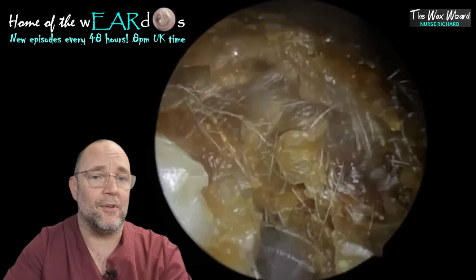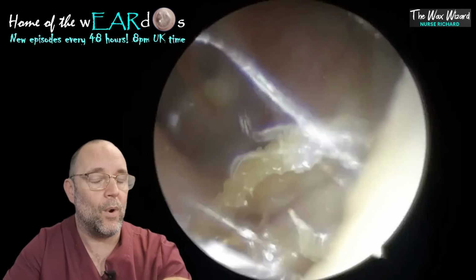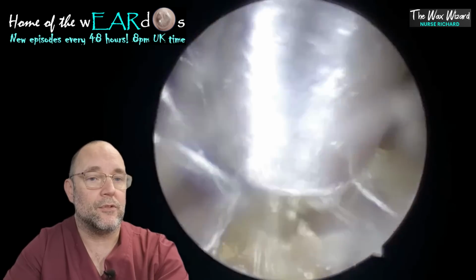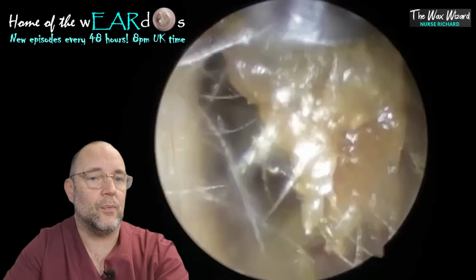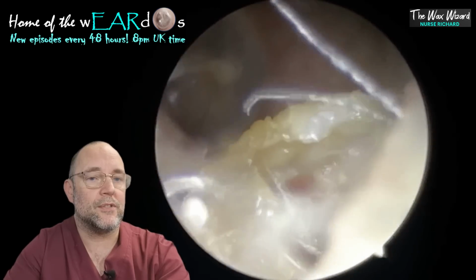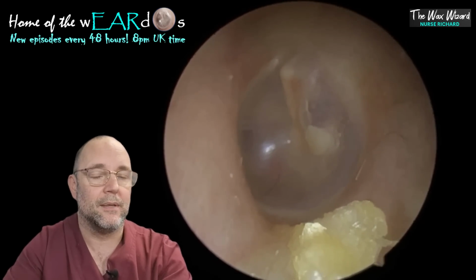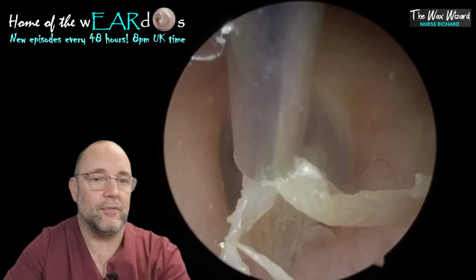Have a look at this that came out of here. Now you see just underneath it, and this is why I've slowed it down, you'll see afterwards, quite soggy underneath there. Now why is that soggy? Now that will become clear in a minute as soon as we get this out. And again, a bit soggy down here as well. So we'll lift that out first, and you'll instantly see underneath there's a bit suspicious down there. I've gone to the fine end tube here because I had a feeling what I was going to find here. Bit of an intuition, but you generally know if you've done it for long enough.